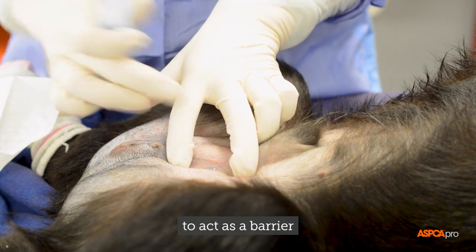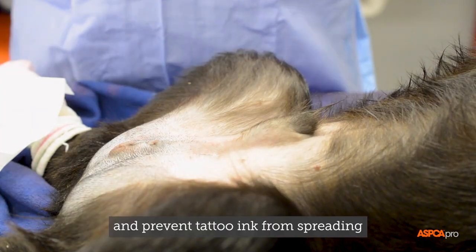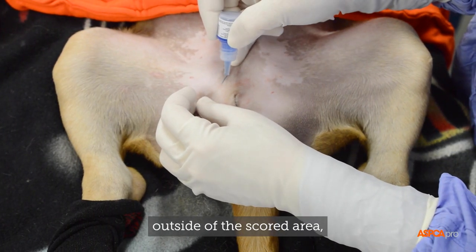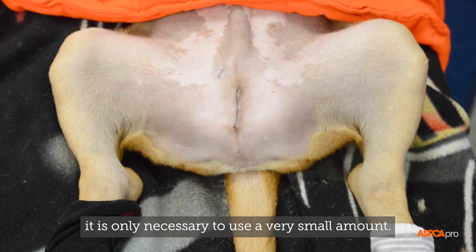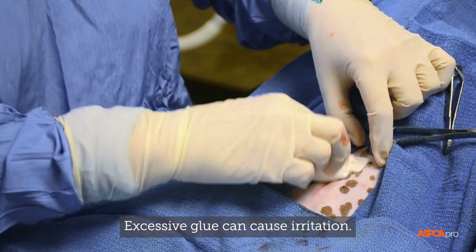The glue is intended to act as a barrier and prevent tattoo ink from spreading outside of the scored area. It is only necessary to use a very small amount, as excessive glue can cause irritation.